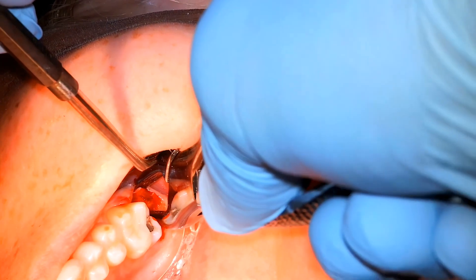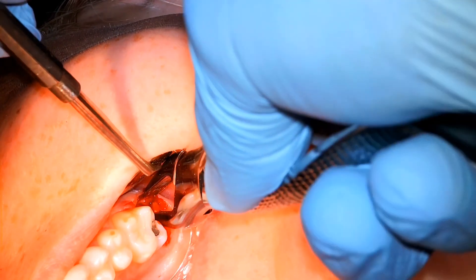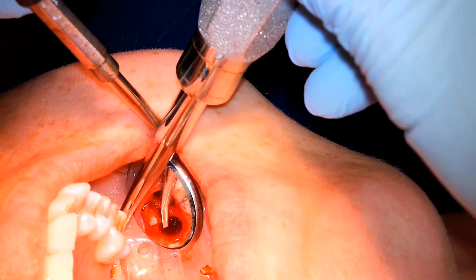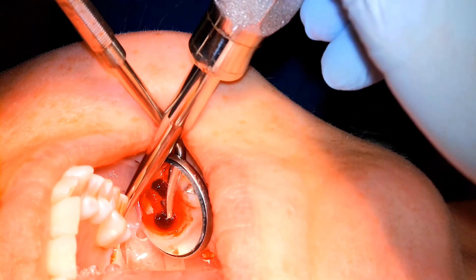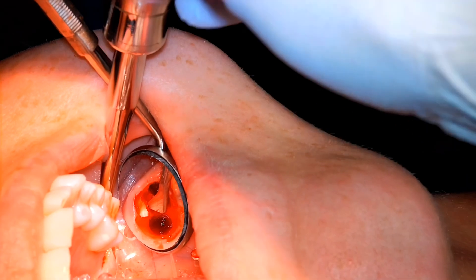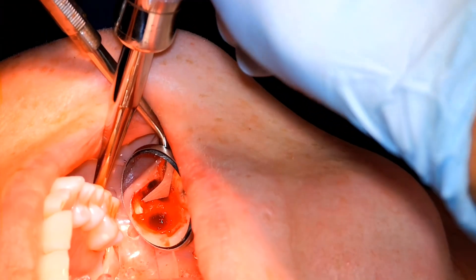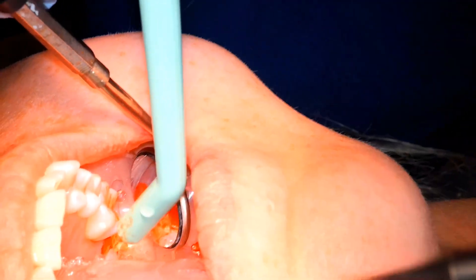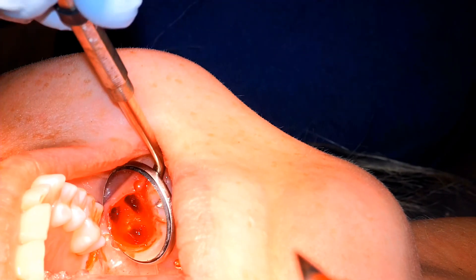The distal root had that decay on it, so we want to grab fairly deeply. You can see it's already kind of busting up before we even grab it — just turns to mush. We're going back with the mini Cryer elevator, engaging that distal root. The Cryer has to be sharp to do this, so make sure it's sharp. We're lifting up and levering with that wheel-and-axle motion, lifting along the path of withdrawal. We're left with a very nice socket — the gingiva isn't affected, bone is barely touched, no injury to the sinus. All is well.